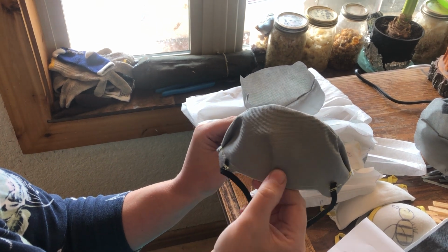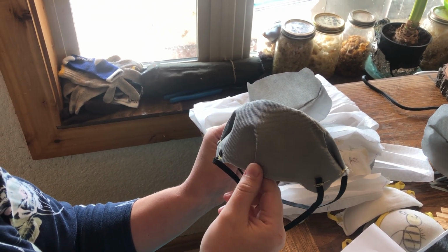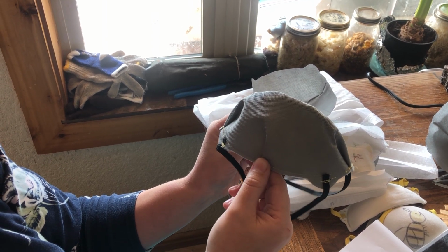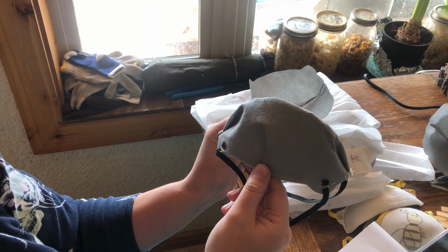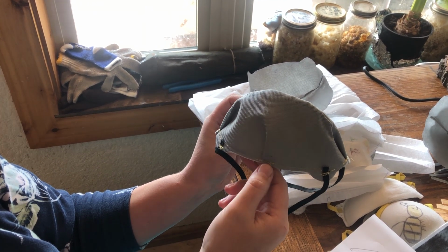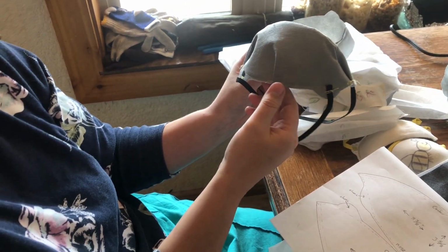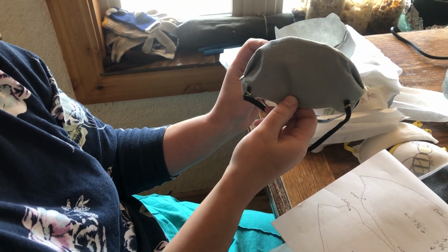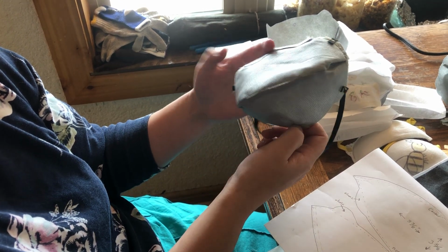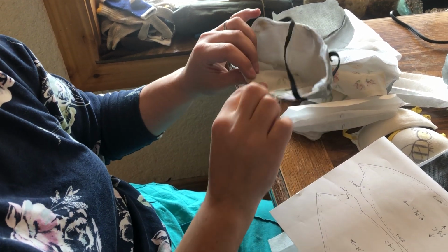I put this in this morning because I realized after a long period of time my jaw was getting sore because I was breathing through my mouth, because my nose was still a little bit squashed. It's like, okay, well, so I put this little pleat in, and it helped me, and that may just be a size of your face issue. I don't know if this is something we should do in all of them. I think I'm going to go ahead and do it now because this made this a lot more comfortable for me. So then I have my foam in there.